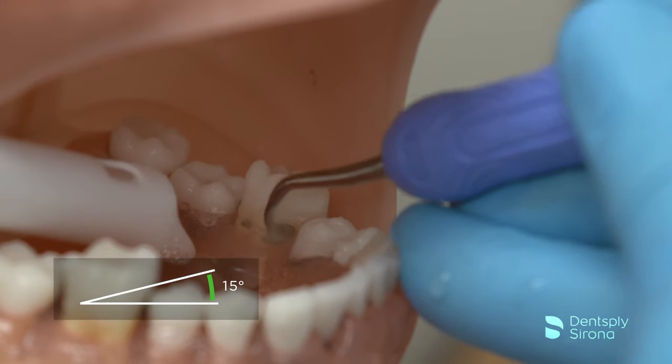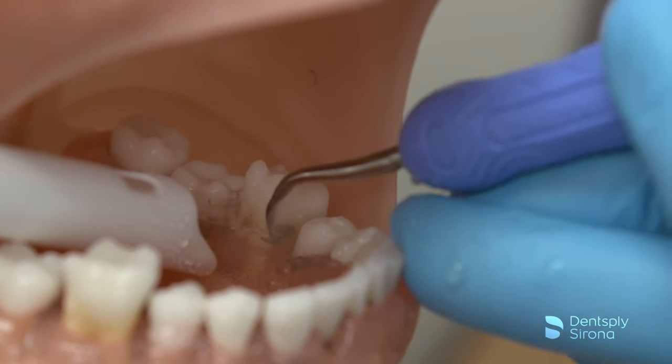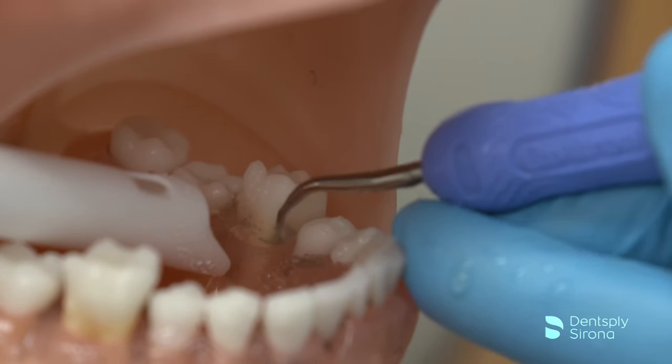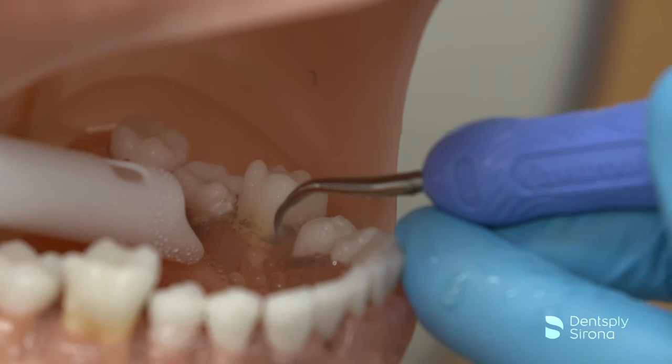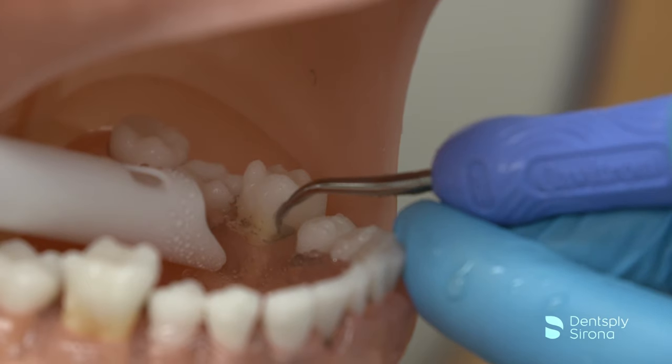The clinician utilizes strokes in the horizontal, transverse, and vertical orientation to microfracture and pulverize the deposits. Adaptation of the terminal end is essential for effective removal and protecting the tooth surface. Thorough biofilm removal and calculus is achieved with an overlapping methodical stroke pattern.